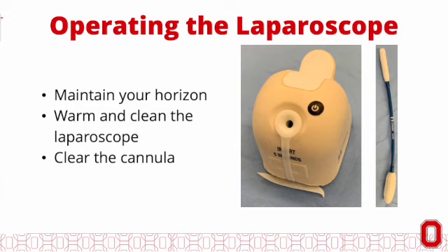Medical students are commonly asked to guide the laparoscope during the case. It is important to remember to keep the buttons facing directly upward, referred to as keeping the horizon flat, while ensuring that the lens remains free of debris and all relevant structures are in the frame. It is also important to keep the surgical field centered in the view.